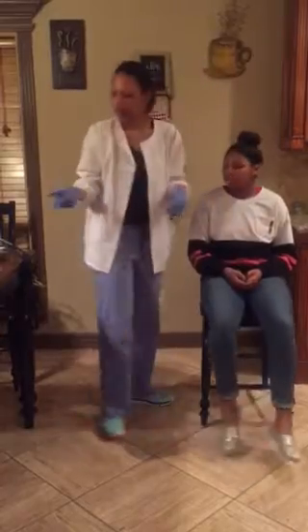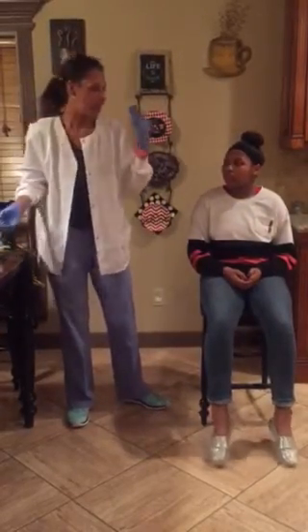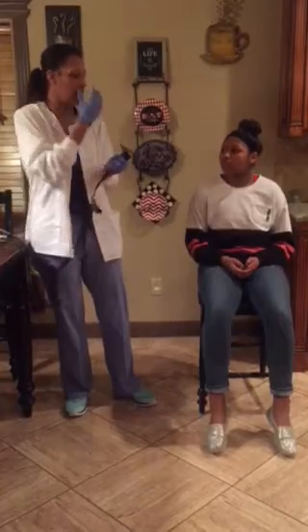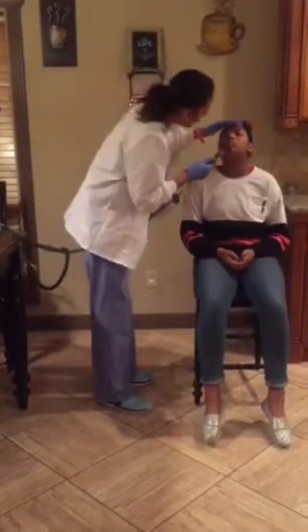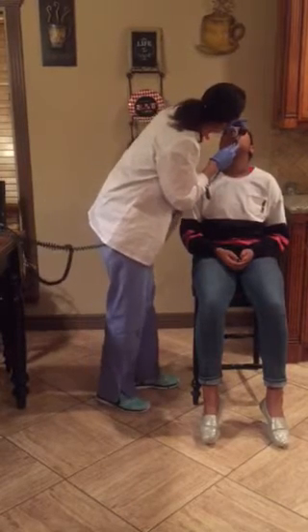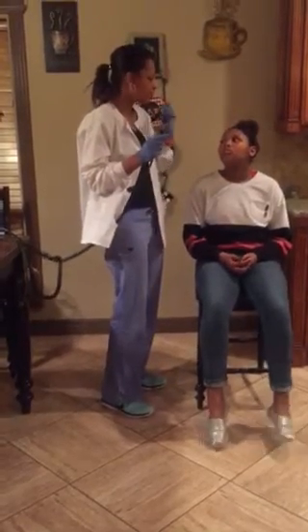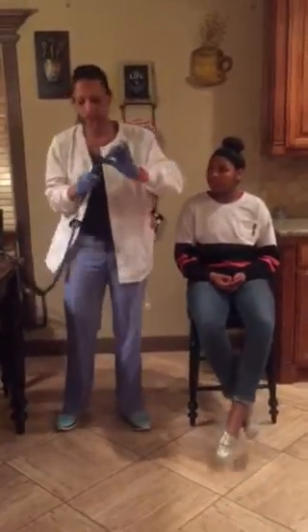Okay. Now I'm going to use the otoscope, which I'm also going to use for your ears, but to look up in your nostrils, just to see how your mucous membranes look up there. So if you can tilt your head back for me, I just want to take a look, kind of shine in your eye, shine in your nose, I'm sorry. No kind of dryness, no problem with nosebleeds or anything like that? Okay.